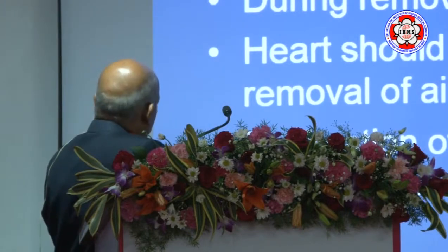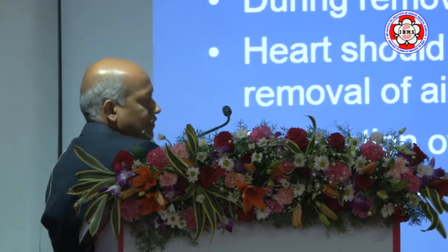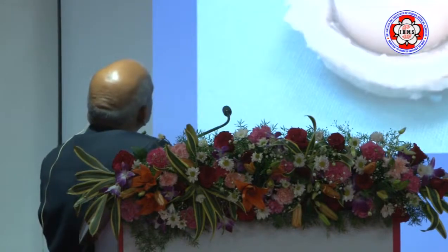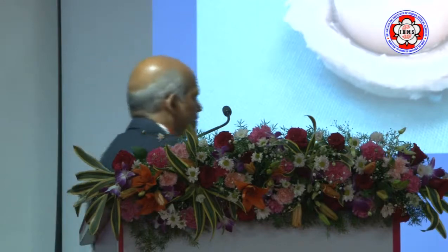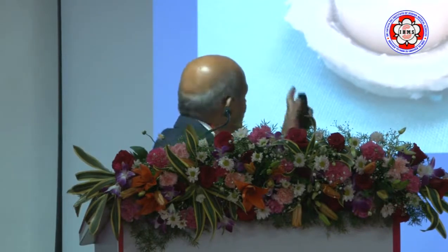Again, perforation of the posterior wall of the ventricle from a prosthetic valve strut can happen, of course, more common with the Starr-Edwards valves. This is one of the valves I explanted about 37 years after implant. He was 18 or 19 years old when he had the operation, in 1977 or 78. Just came back three months ago, he had a large aortic aneurysm. 37 years, still functioning very well. There is no ball variance, there is no trauma to the struts. So just to show you that mechanical valves, if properly taken care of, could last for the life of the patient.